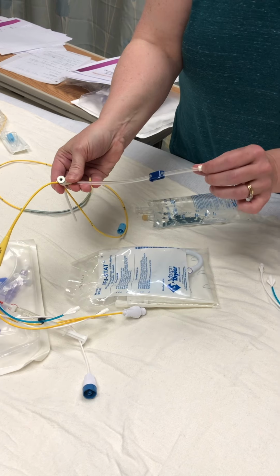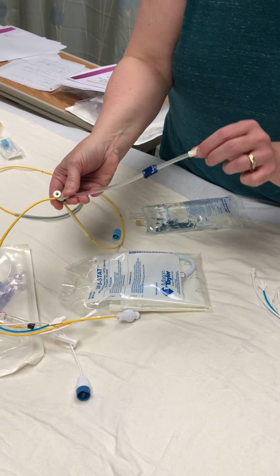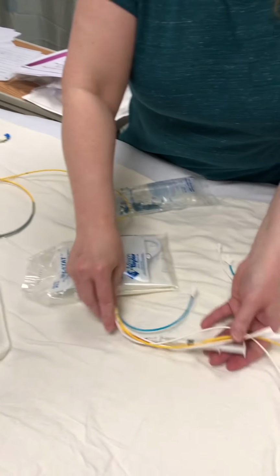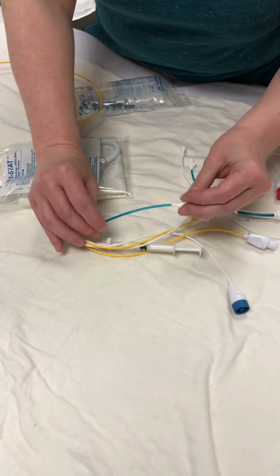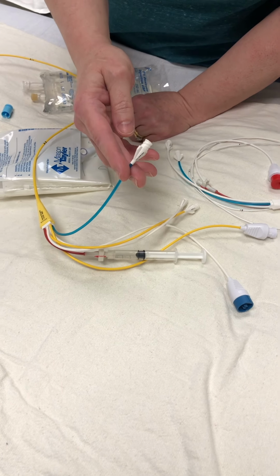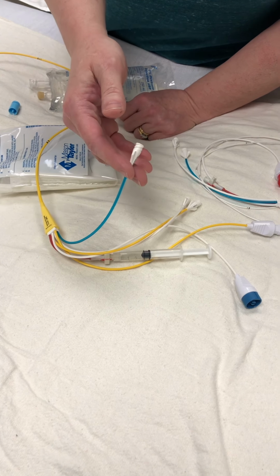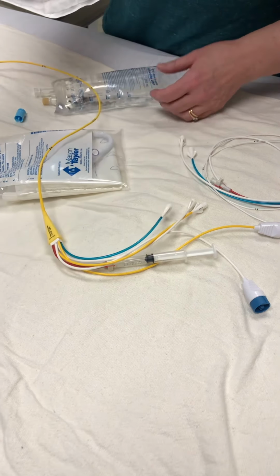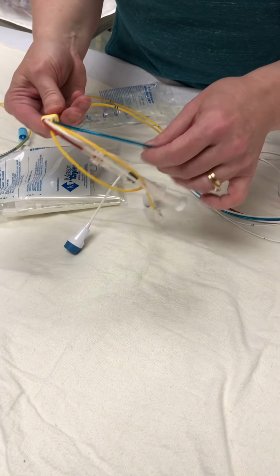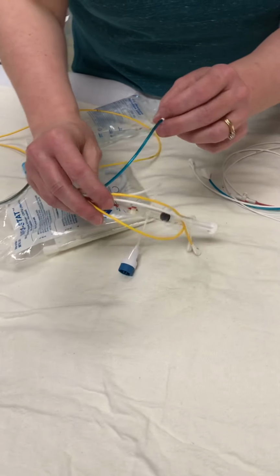In a regular patient, you can use this as if you need to give fluid boluses, but typically in our open heart, we use this for our antihypertensives. The other ports you're going to see, this is your prox injectate. This typically is where you're going to have a maintenance TKO line where your antibiotics, your IV pushes are going to go. In an emergency situation, all of a sudden your patient codes, where do you put your lines? Think blue, code blue. This is a good port to have open just to give your emergency meds.